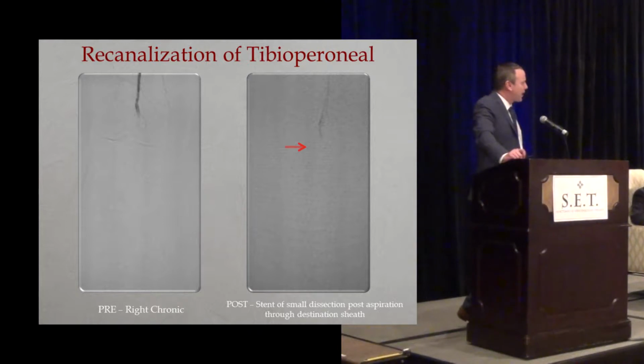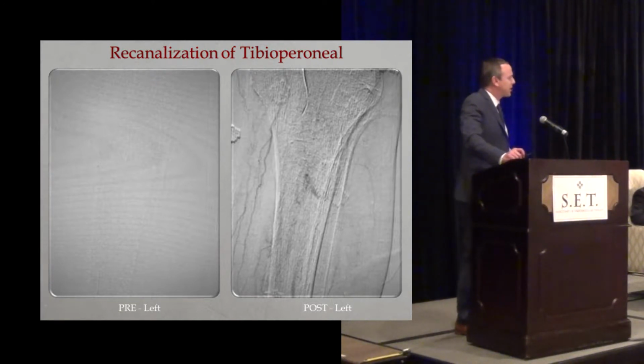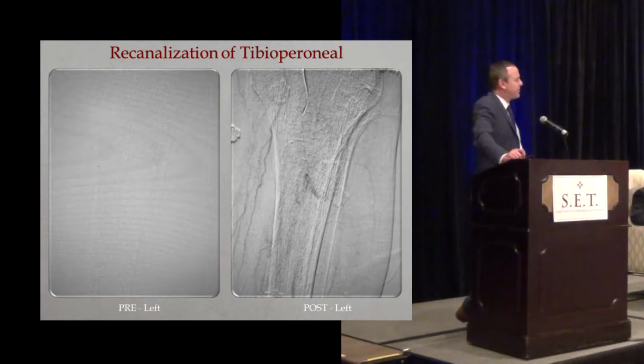We admit her, we put her on heparin, and then you can see here, this is post-procedure. There was some underlying disease there. I did in this one case create a very small dissection, but we had a nice result there. We then went and treated her other side. You can see here again a clot on the contralateral leg, completely shutting off the flow right at the tibioperoneal trunk. And then this is post-procedure, and this is actually sucking out the clot in about 10 to 15 minutes. So no lytics were utilized in this case.